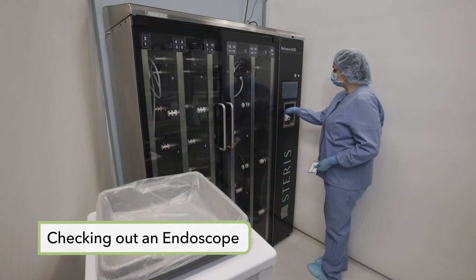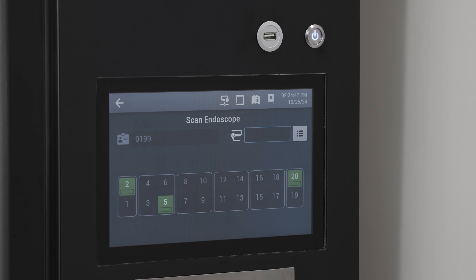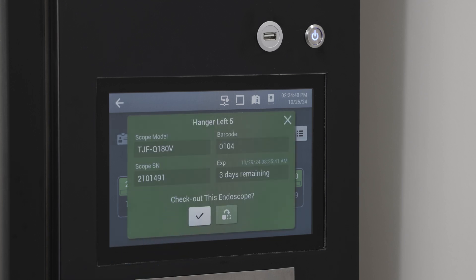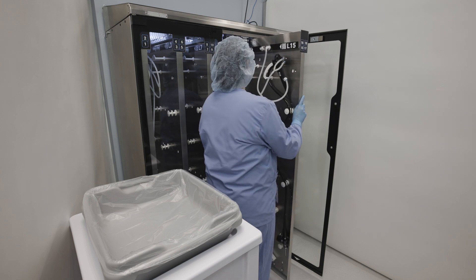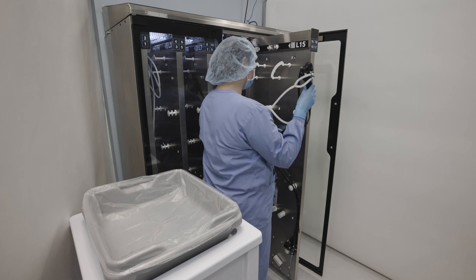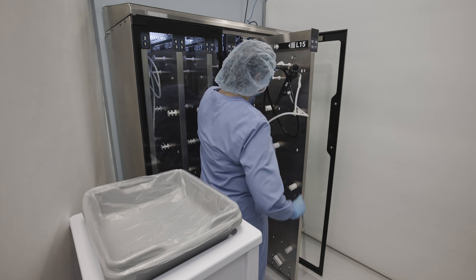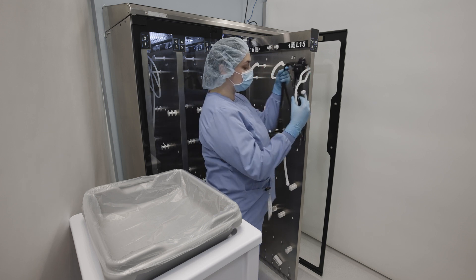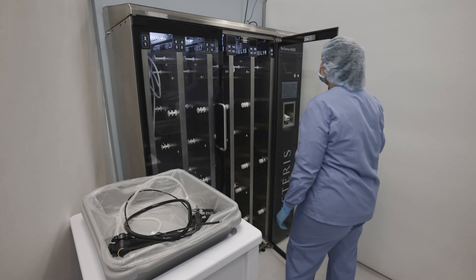Prior to checking out an endoscope, the user must be authenticated to unlock the cabinet door. It is recommended that the endoscope closest to its expiration time is used first. Select the applicable hanger icon on the screen to display a dialog box and confirm the endoscope check-out. A pop-up confirms the endoscope was successfully checked out. The cabinet door can then be opened and the storage panel extended. Disconnect the tube set from the manifold and remove the endoscope from its hanger. If additional endoscopes are to be removed, repeat the removal procedure or close the cabinet door.